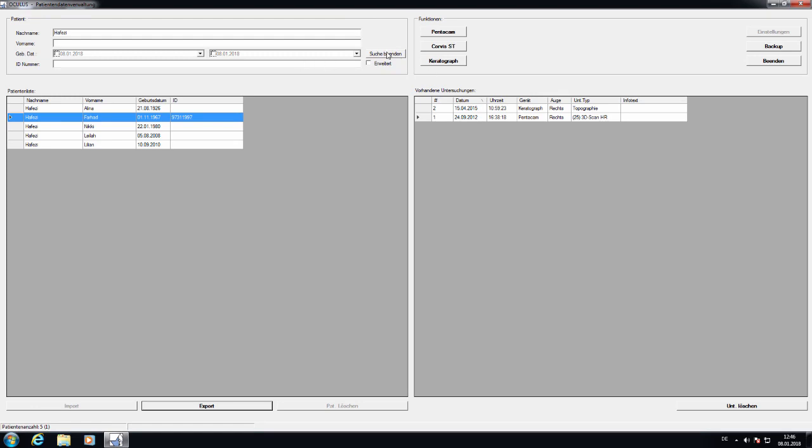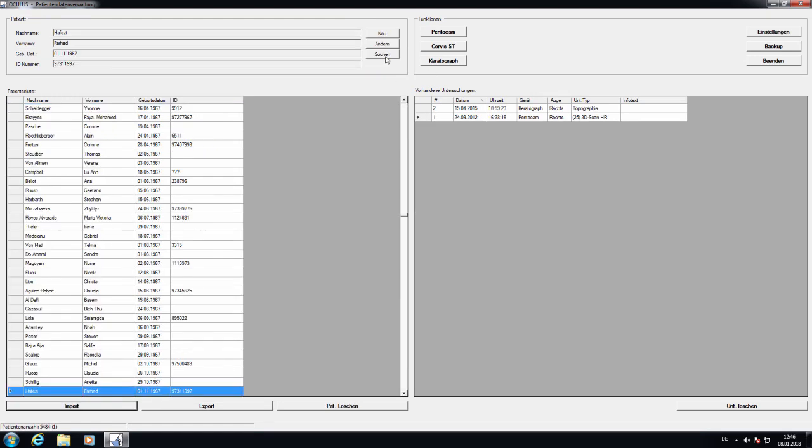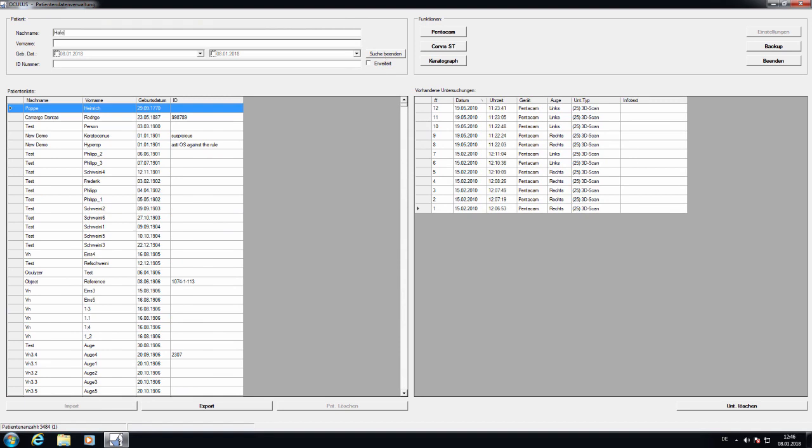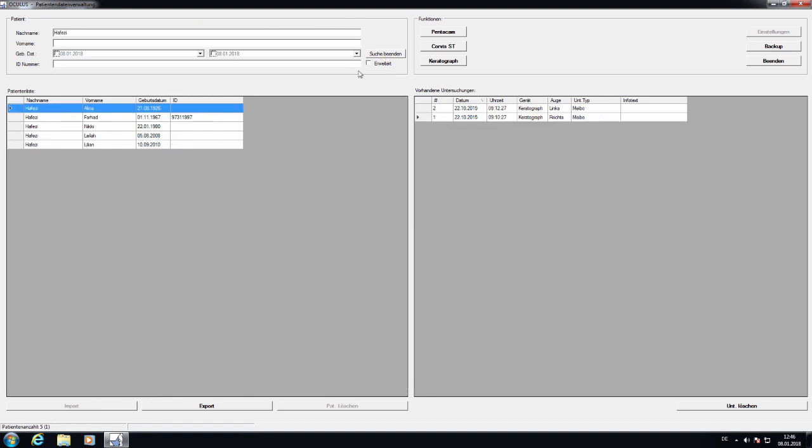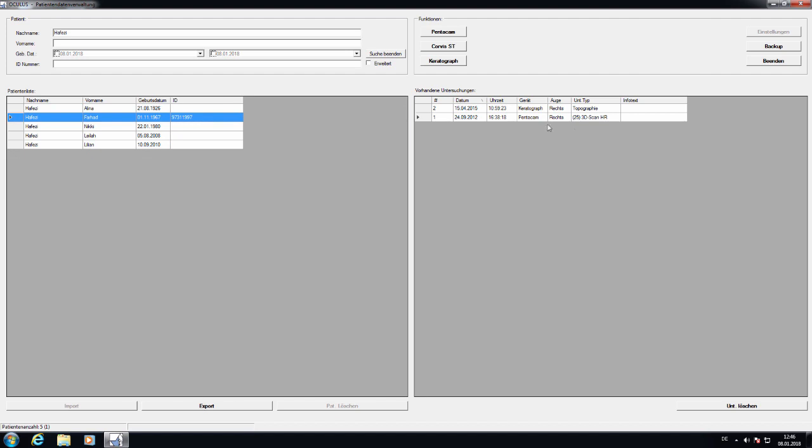Basically, you first have to put in a name and let's take my own Pentacam. I can now see that two exams were performed in 2015 and 2012. One is keratograph, one is a Pentacam.